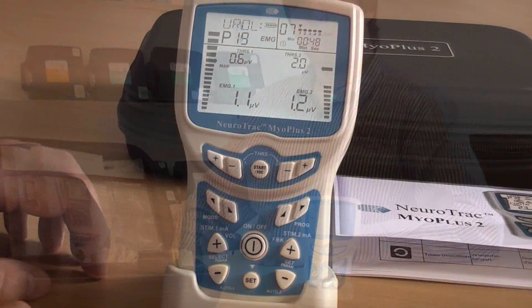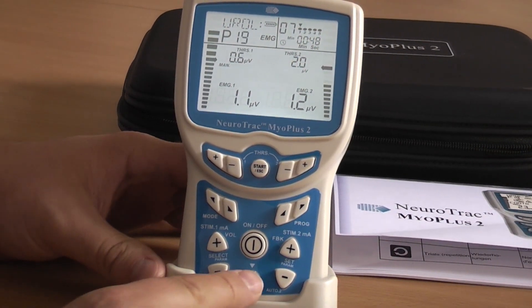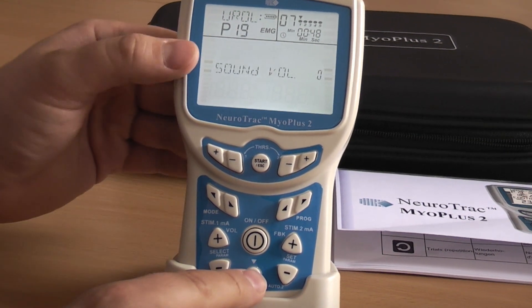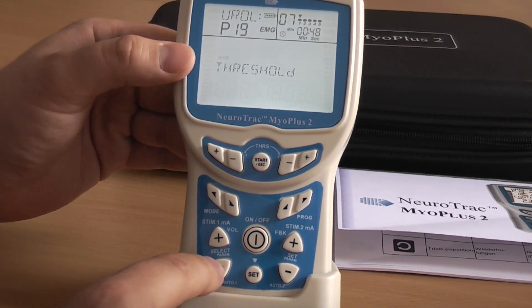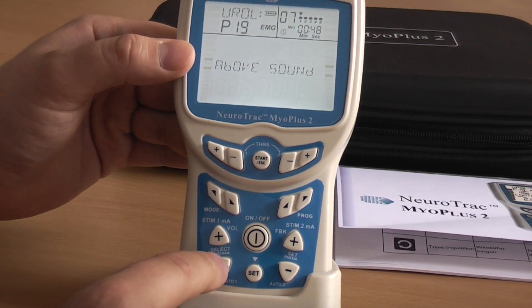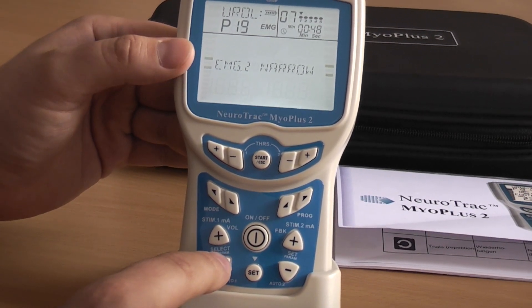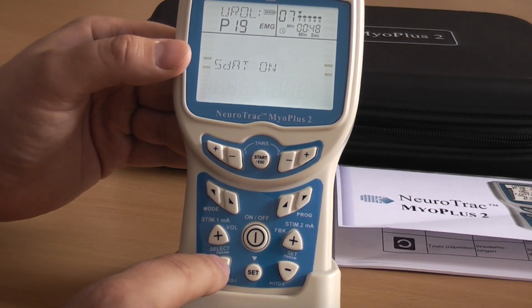The preset treatment is fixed, but you can still change the common parameters, such as sound volume and PC connectivity. By pressing and holding the Set button, you can change, for example, sound volume, auto or manual threshold, bar graph sound, EMG filter, and the PC connection status. If you cannot find the parameter you want to adjust, you can find it in one of the custom programs.